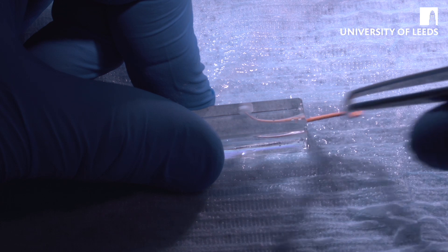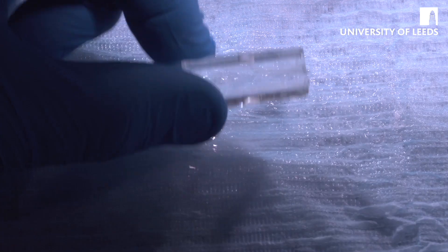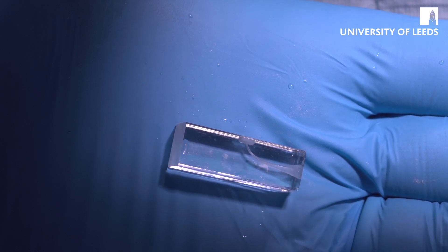At that point you're either ready to dress the tooth or ready to obturate it. That's the preparation we want to demonstrate — a nice, smooth, tapered shape from top to bottom following Schilder's principles as discussed in the lecture.